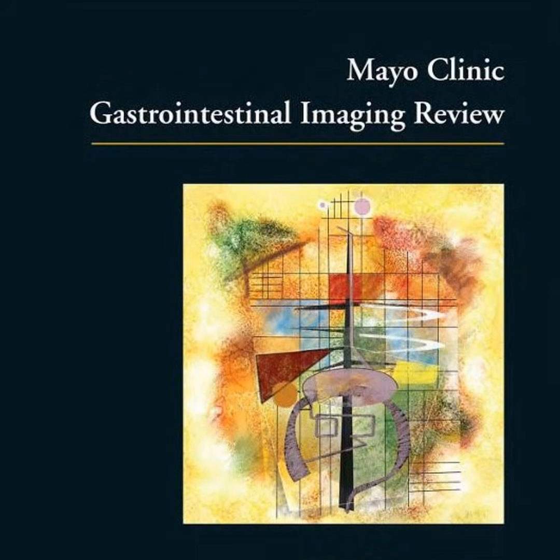It is time for a clinical review exercise to test your translation skills. All right, listeners, this is for you. Step into the clinical scenario. You are evaluating the imaging and chart of a patient with a known history of advanced cirrhosis. The abdominal ultrasound reveals complicated ascites. The fluid is not simple and anechoic. It contains prominent echogenic floating debris and dense septations.